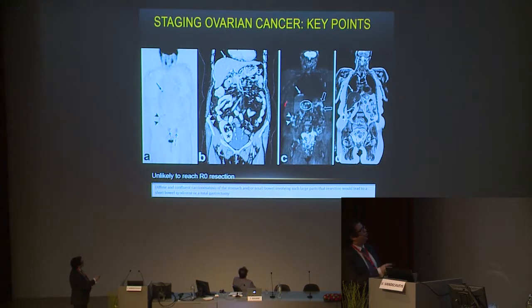Well, look at your diffusion MRI. This is a big deposit on the diaphragm. On the right side, there is invasion of the right ascending colon. In the pelvis, actually, it is just confluent tumor around both ovaries, invading the sigmoid. And also here, we have invasion of the colon at the left splenic flexure. Multiple small nodules on the mesentery, no invasion really of small bowel, but then here also in the hepatogastric ligament, multiple metastatic lymph nodes.